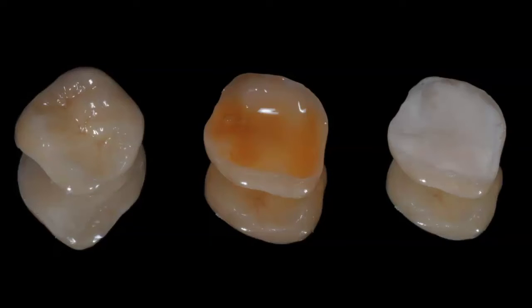There are many concentrations of hydrofluoric acid. Some are 5%, some are 9.6%. Many people like to use the lower concentration for lithium disilicate. I don't think the difference is that critical. The most important thing is the time of etching. For this particular case, I'm using 5% hydrofluoric acid, and I'm going to leave it on the intaglio surface of that restoration for 20 seconds.